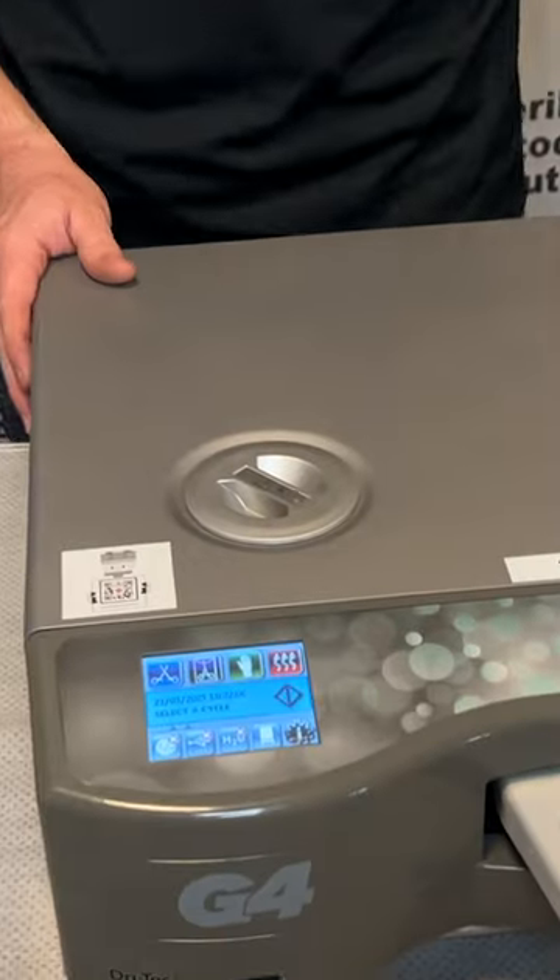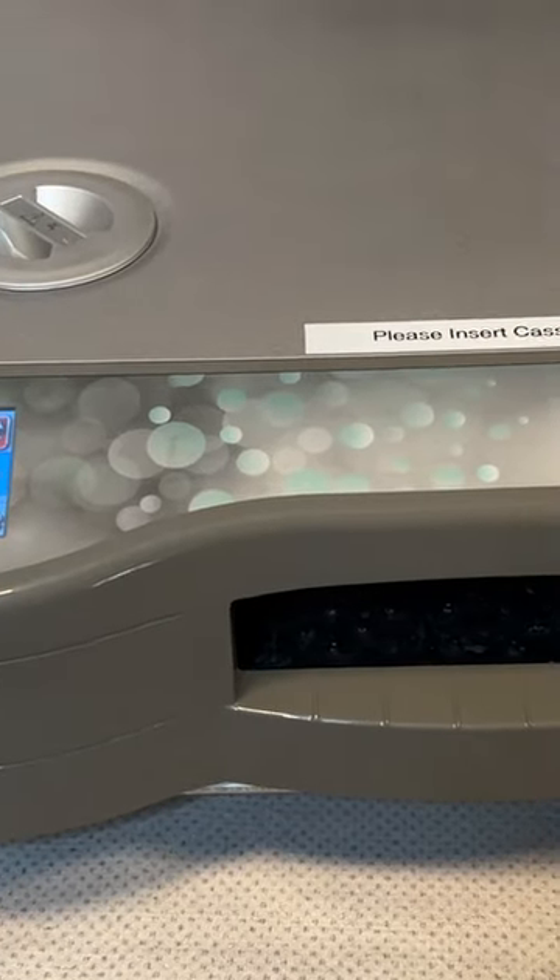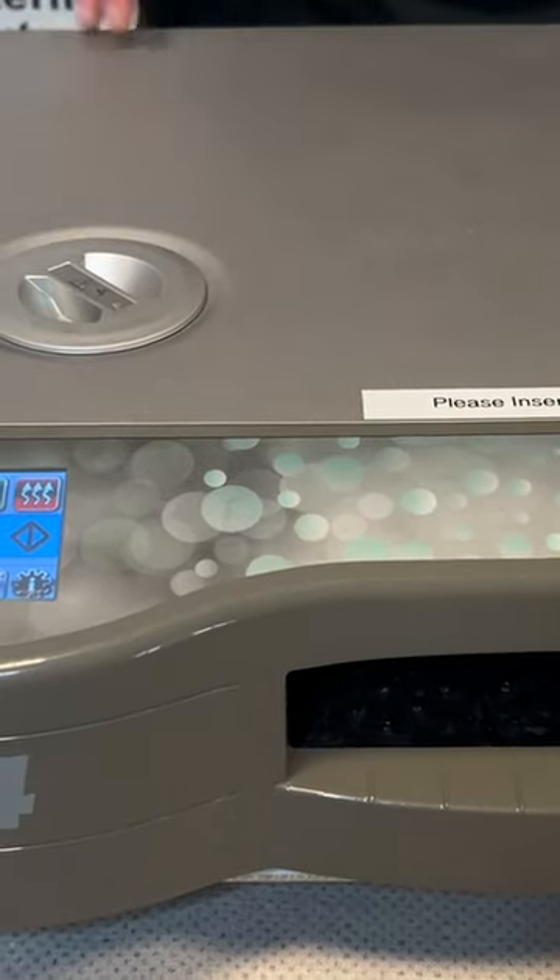Hi, this is Ian with Sterilizer Audiflave Solutions. Today we are going to be doing the two-year PM kit on a STATUM G4-2000. First thing we're going to do is remove our cassette and set that off to the side. You're going to want to have access all the way around this unit.